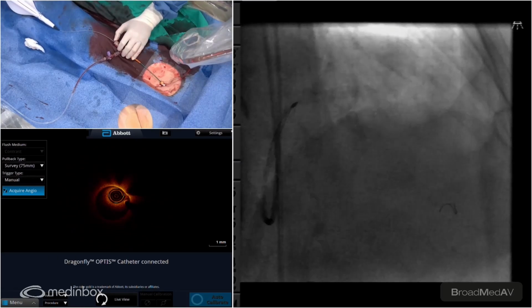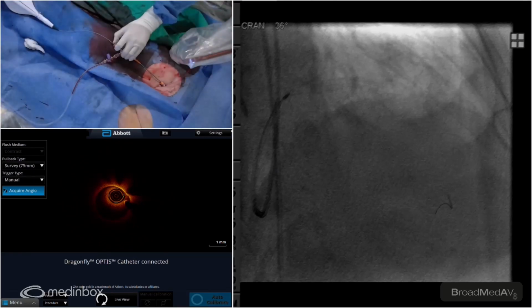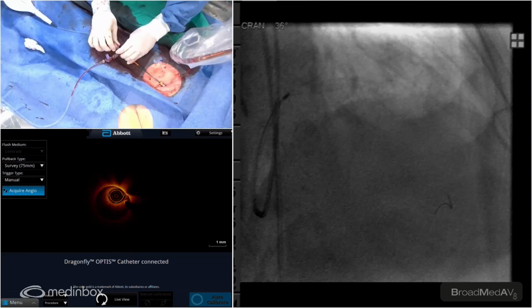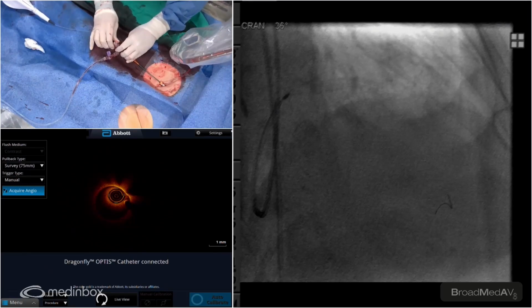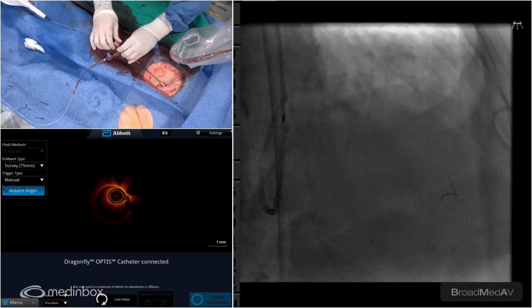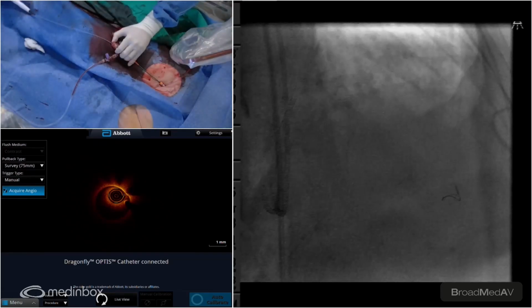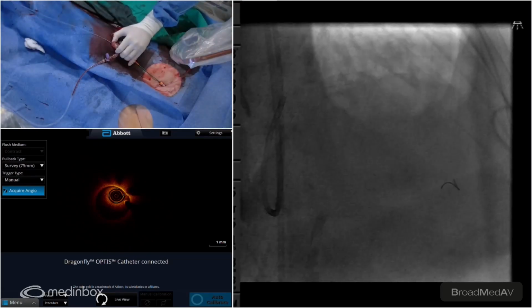Sorry, let me just open this up. Copilot's acting up. It's locked. Can you take it out? Let's see. Oh, I can start, yes. Perfect. Go for it. Can I get one of those good co-pilots? Do we have one of those? You want a Guardian? The special ones, the good ones. The Guardian. Yeah, it's the Guardian.